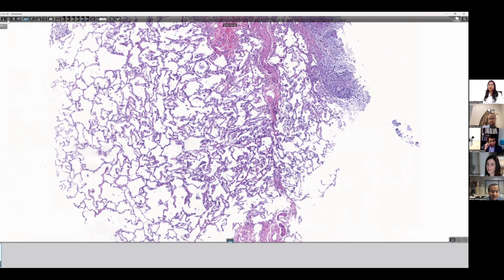Got it. Yes. Raghav, Matt, anybody? Same with me. Common things first, and just like how we should not think about berylliosis, I don't think about sarcoidal-like reaction, because for me, when I'm looking at a granuloma, the most important thing is necrotizing versus non-necrotizing. I will stick to the basic approach of the granuloma. I will not try to make some weird combinations which don't fit my thought process. So I've never gone to sarcoidal-like reaction whenever I looked at a granuloma.